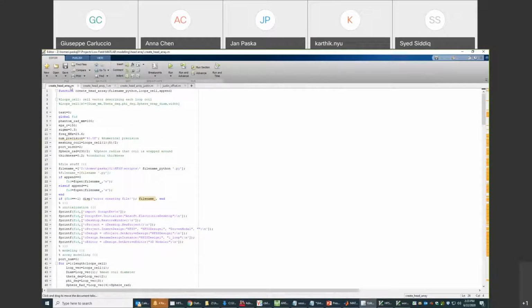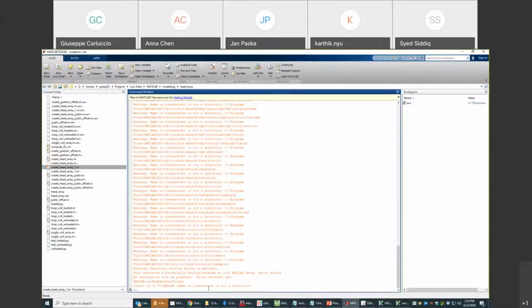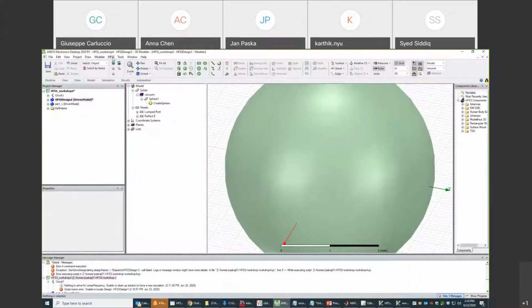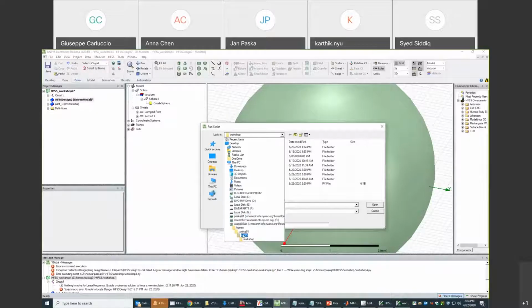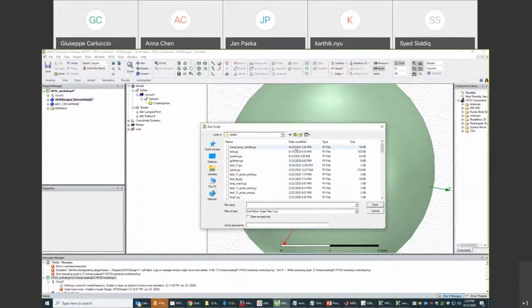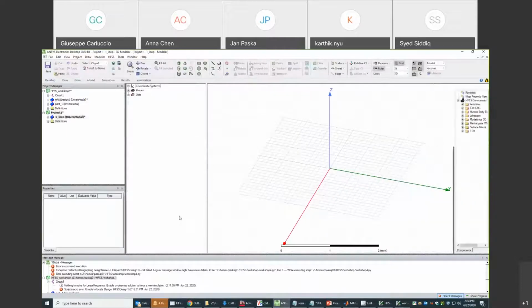So let's just run it. Create test coil array 1. Just for you to see what you can do with this. File name head array model. So now let's navigate to this Python file that I just produced. This file here was produced today at 2:24, so that's right now. So that's the file that I created with MATLAB. We can have a look at how that looks. But I'm going to run it with HFSS, and meanwhile we can have a look at how that file looks, because it will take some time until it's finished.